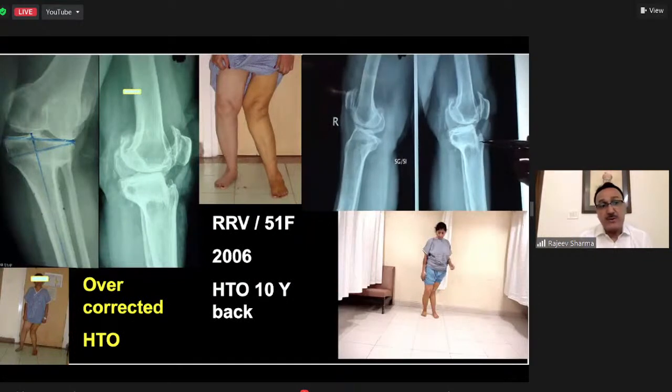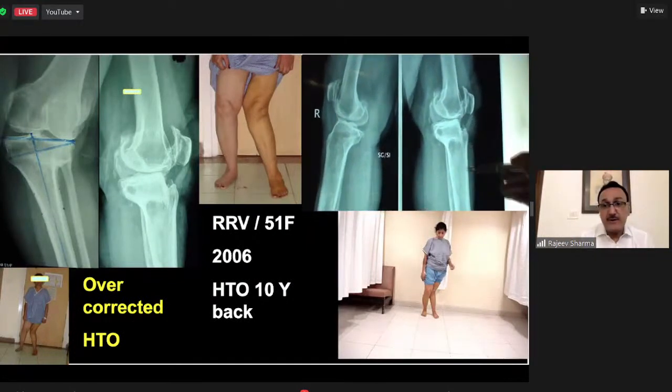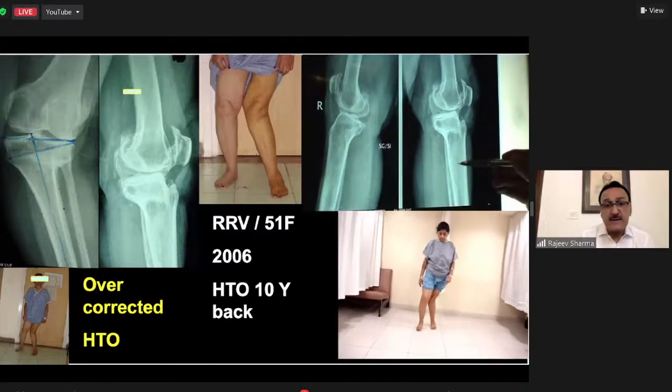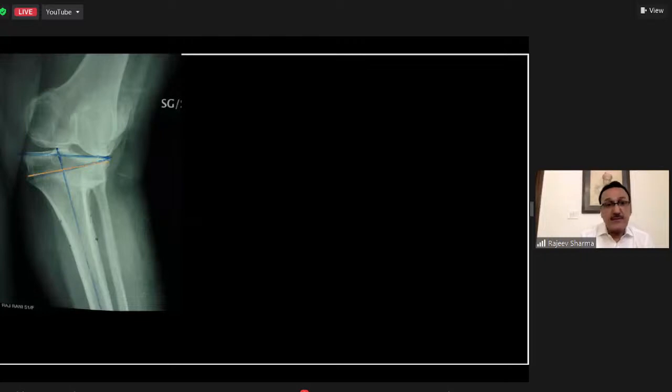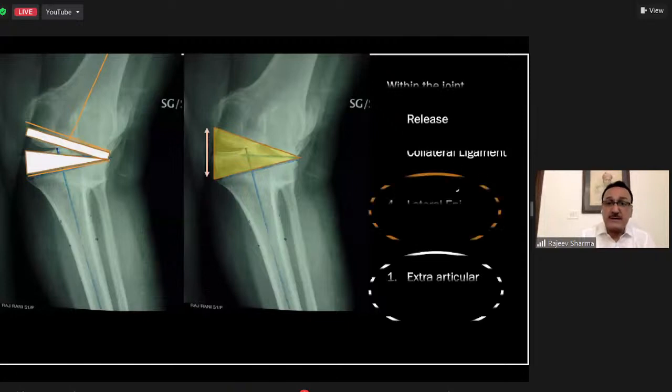The tibial osteotomy, this is the hypercorrected high tibial osteotomy. What you see here, this patient has significant valgus. And in this patient, if we go for the normal tibial and femoral cuts, what you will end up with is a large amount of gap medially, which will be a very, very unstable joint.